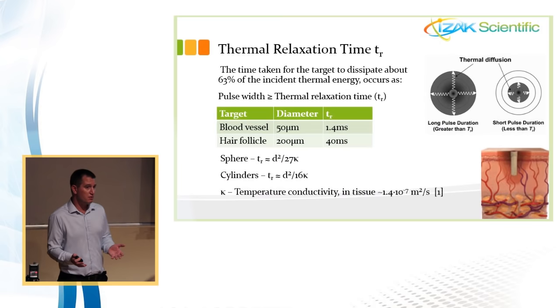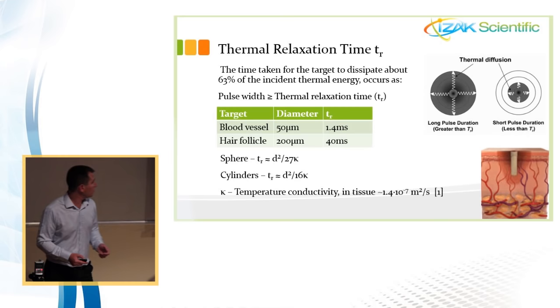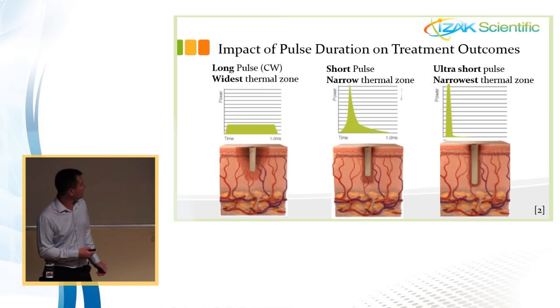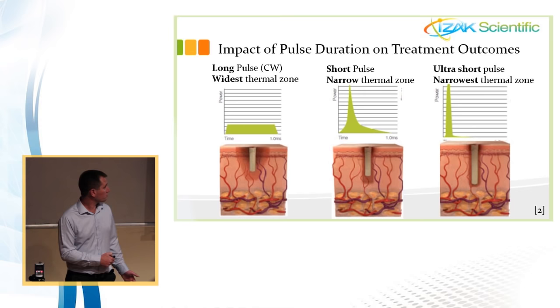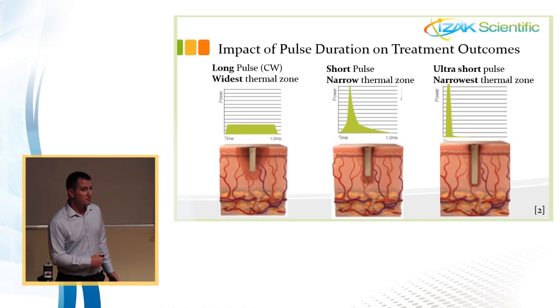For example, here you see the coagulation zone. It's easy to calculate, but it depends, of course, on the geometrical aspects of the tissue that we want to consider. Here is the effect. We see that with the ultrashort laser, the penetration and the ablation are very clean. Then the laser can be used as a surgical scalpel or to incise the tissue. If we use a pulse width that is a bit longer, then there is a coagulation zone. And if we use a continuous wave or tens of milliseconds, then there is a larger coagulation zone. However, for everything there is a medical application that suits it.